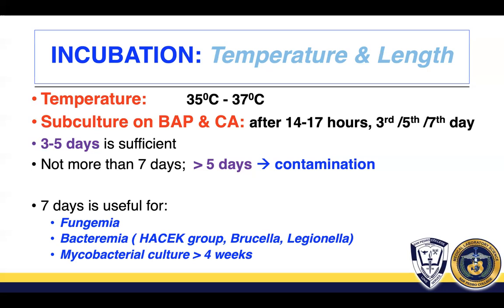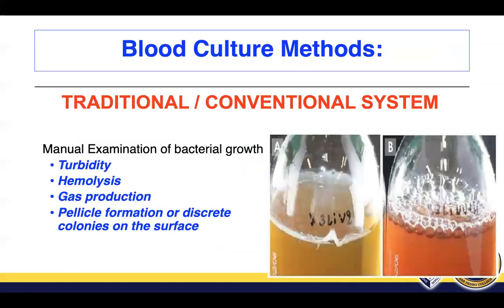Of course, mycobacterial cultures usually grow after more than 4 weeks of incubation. So ideally 5 days of subcultivation is enough, but then again, there are those organisms that would require a longer incubation period. So we have to know and follow their incubation requirements.